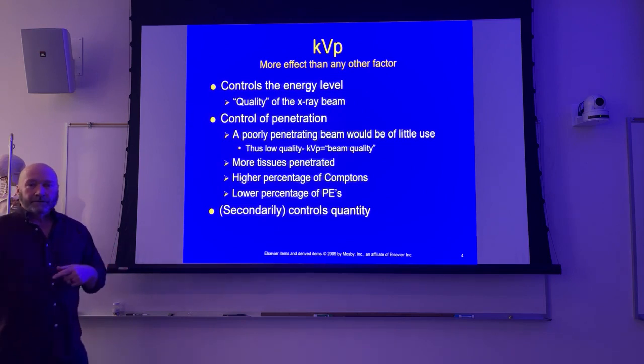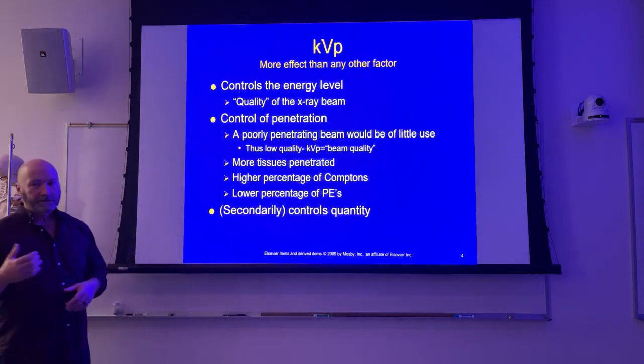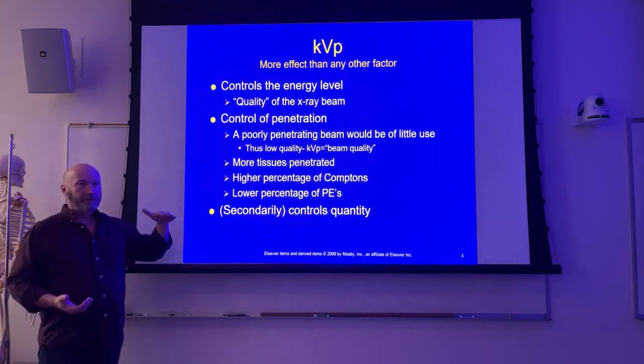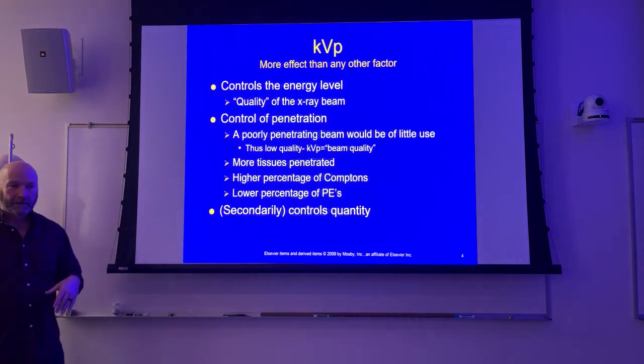So that was the original technology that most hospitals changed to. Instead of jumping directly into DR, it was a smoother transition to CR. The problem is that whenever we went to CR, the CR systems required more radiation than screens and films did.